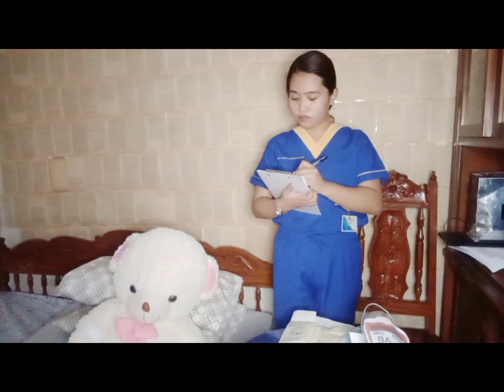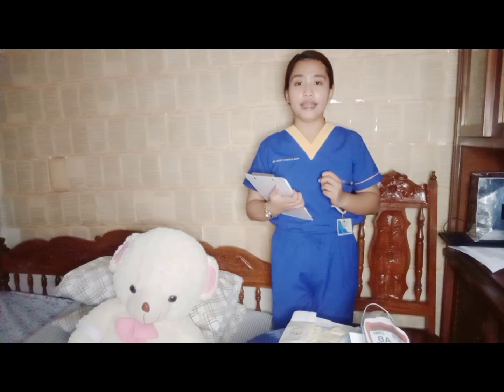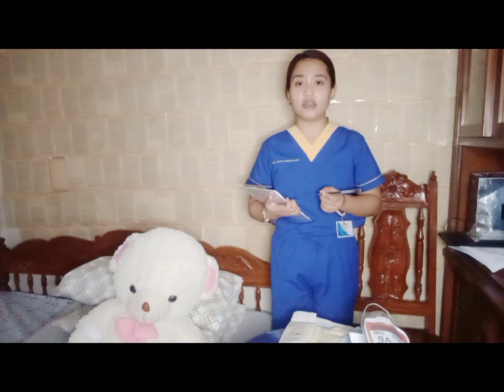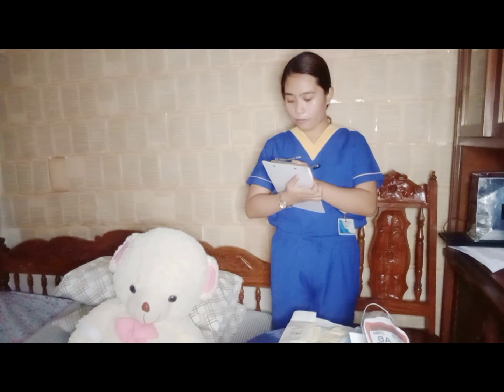Prior to the procedure, first we need to verify the medical order for blood transfusion. Then, the completion of informed consent. This means that the patient is informed about the risks and the benefits of this procedure. And the pre-transfusion medication. If it is ordered, we need to administer this medication at least 30 minutes before the transfusion. These medications decrease the risk for allergies and febrile reaction for the patient who has had a previous transfusion.